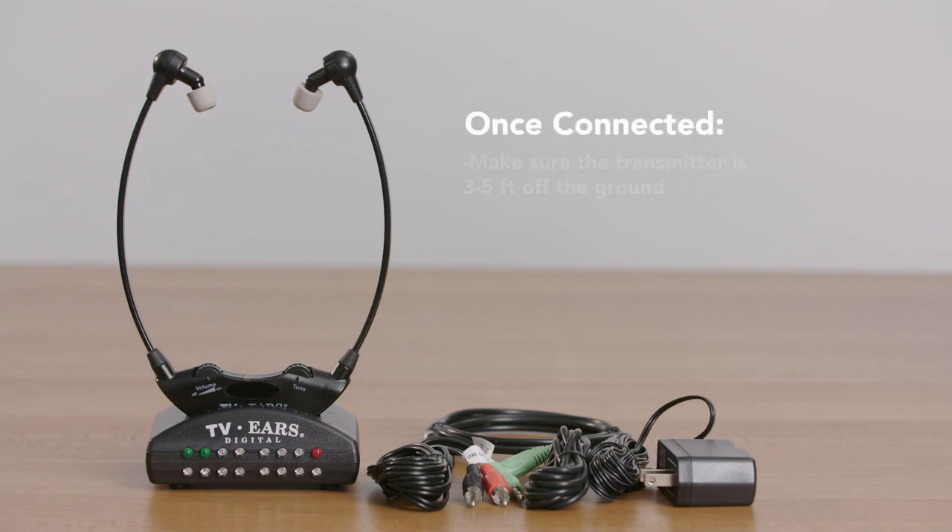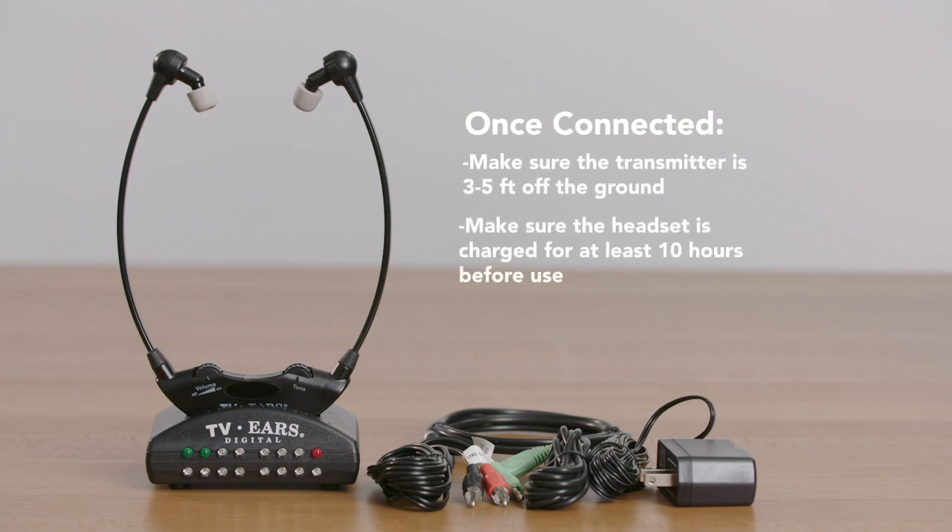Once it's connected, make sure the transmitter is three to five feet off the ground with the lights facing towards you. Then make sure the headset is charged for at least ten hours before use, and you should be all set.